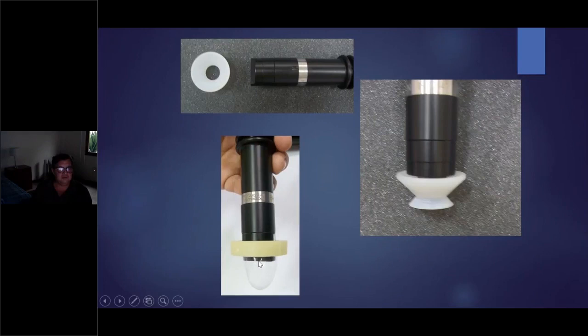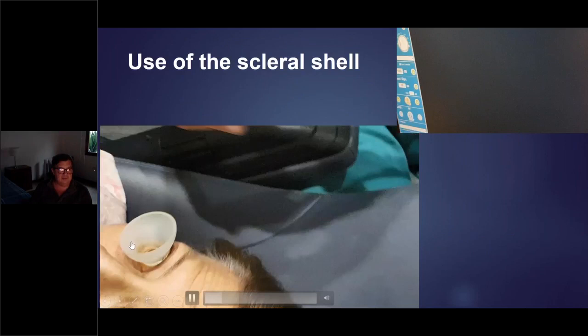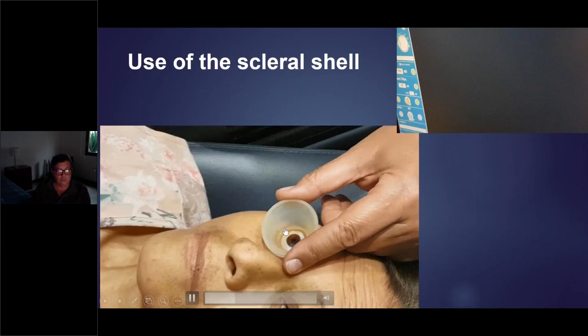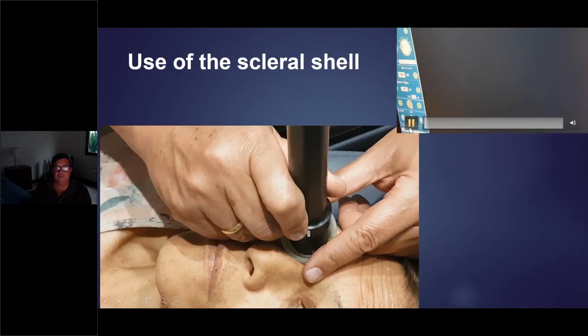You can use scleral shells, different shapes, or clear scan. This is the old one, the new one is the green one. And look, this is with the scleral shell. It's so easy. I have those silicone scleral shells. You put some drinking water, then you put the membrane with the 50 megahertz probe, and at the same time you are performing the examination in real time.